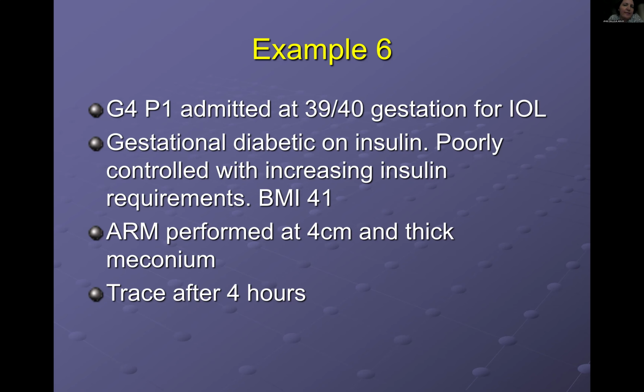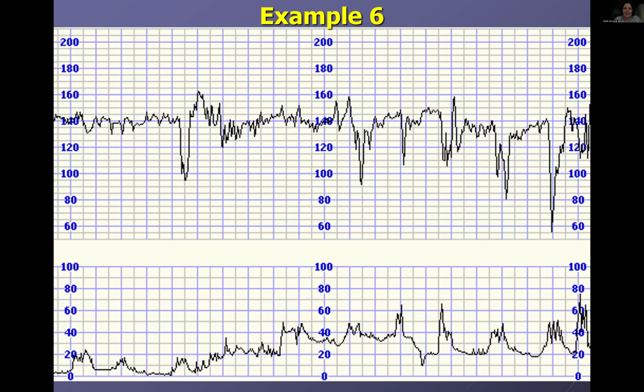So just looking at this history, it shouts at you that this is obviously high risk. You all agree this is high risk, right? It is high risk. So let's have a look at the trace. So this is her trace.